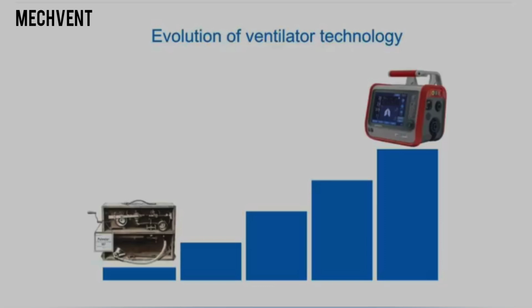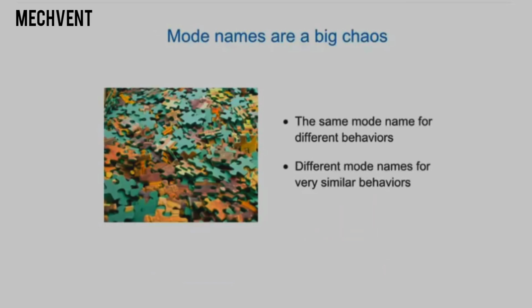To solve this problem, the ventilator industry constantly introduced new modes, some useful and some less useful. Only a few good ones stand the test of time. Naming of ventilation modes is not globally standardized. Ventilator manufacturers are free to name the modes in their ventilators.